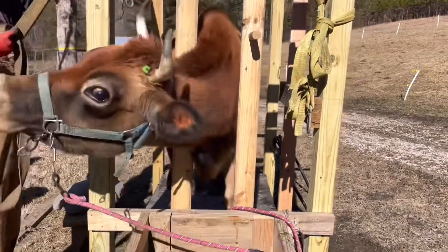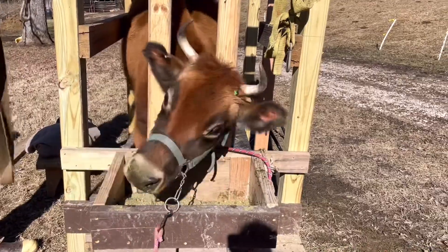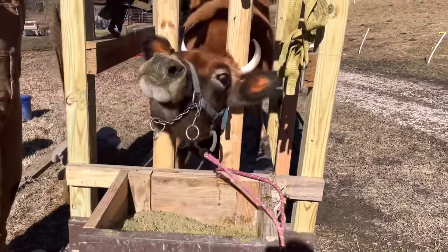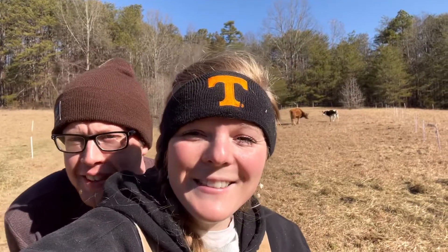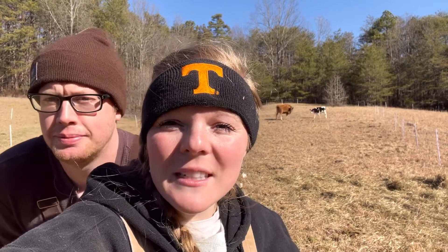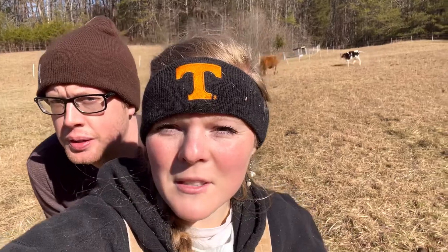Violet's definitely not happy with us. We undid her but she's trying to get these rubber bands off, as you can tell. It's going to be uncomfortable for a day or two, but hopefully this will get better. You can see Violet shaking her head a lot — she's agitated, which we knew would happen. She's not very happy with us at all.